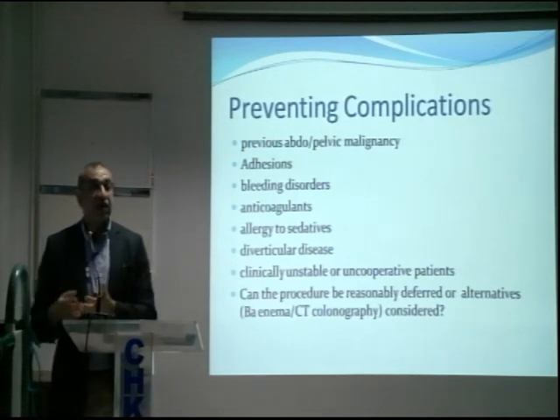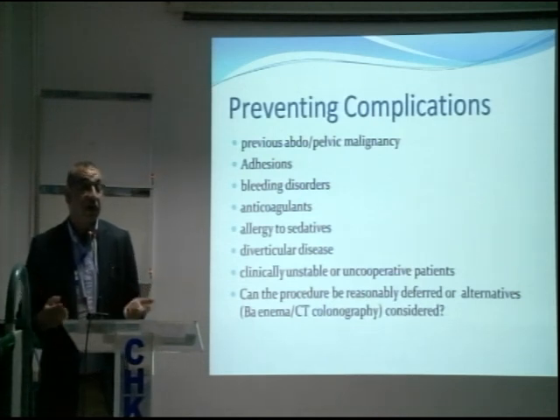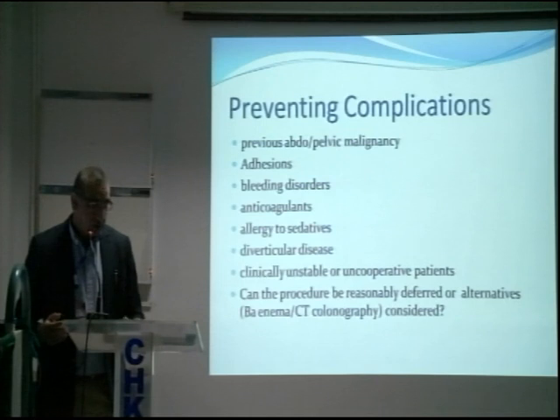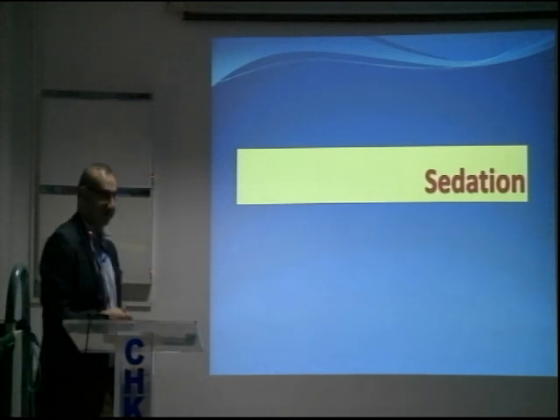Or can something less invasive be done? Nowadays, especially with CT colonography, you can do a CT colonography. It will not only assess the colon for you, but will also assess other organs outside the colon for you. So that's a good escape route. So always question yourself before you do anything. I'll stop here. Thank you.